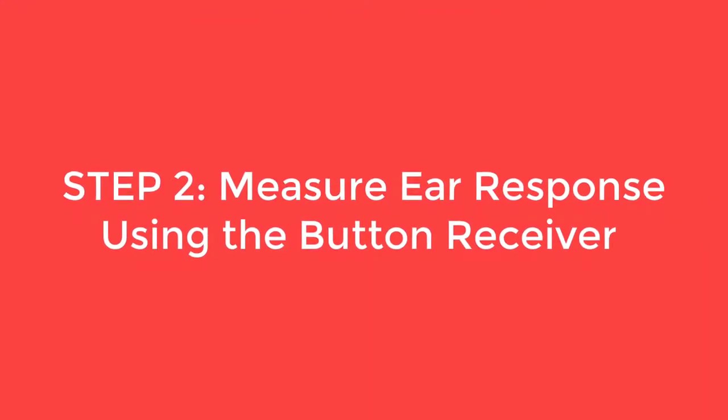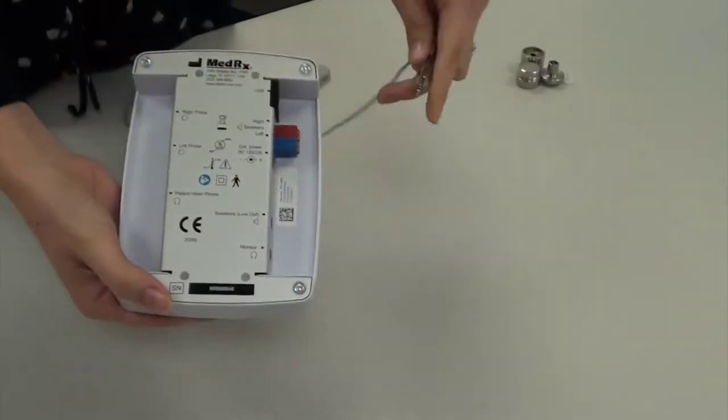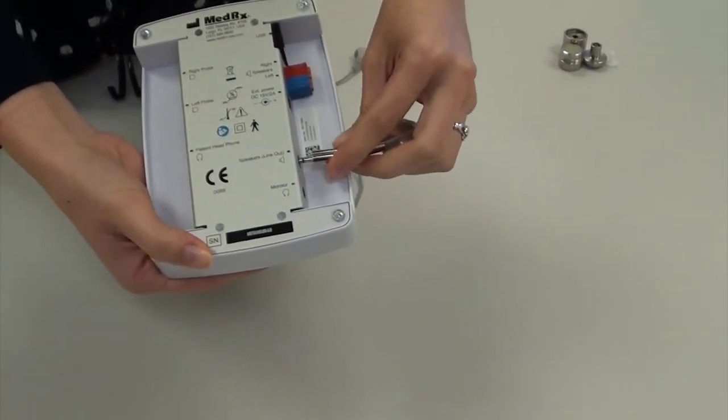The second step is to measure the ear response using the button receiver. Plug the button receiver into the port labeled speakers on the REM plus or ARC system.